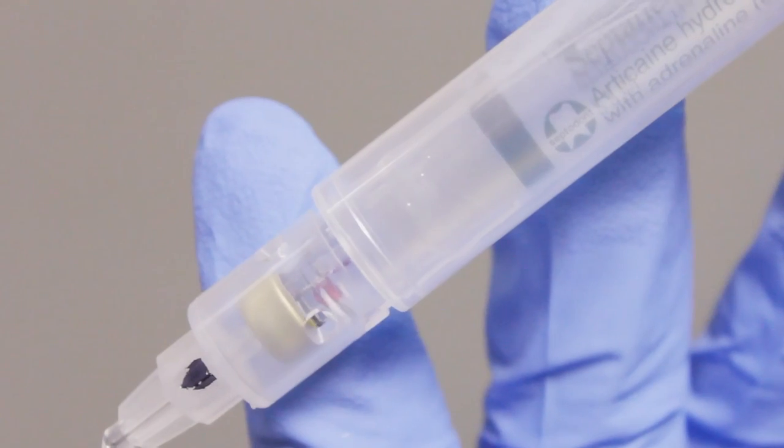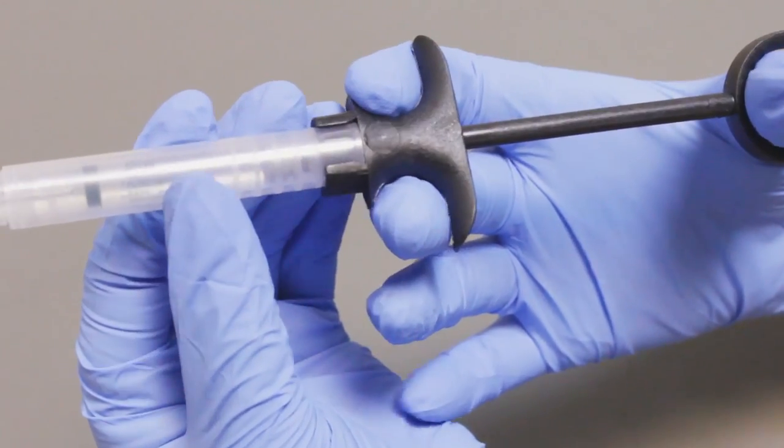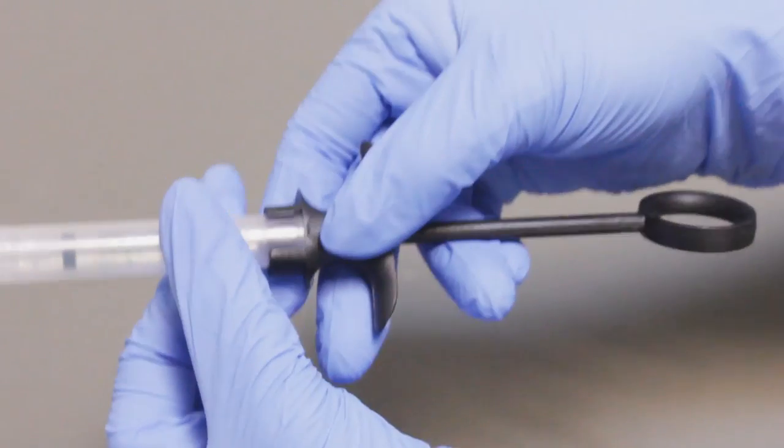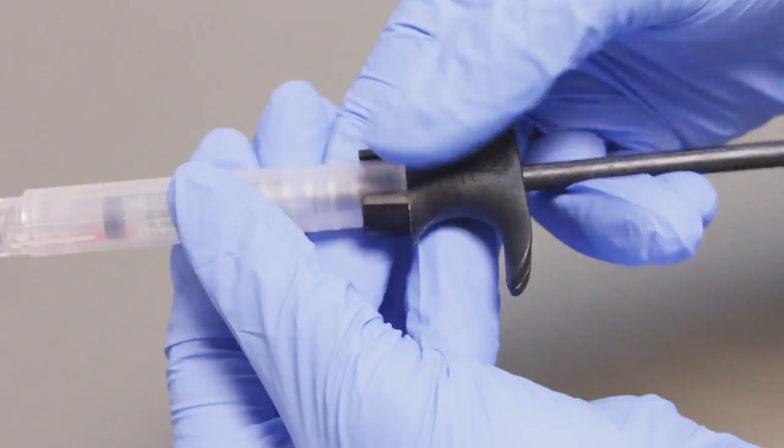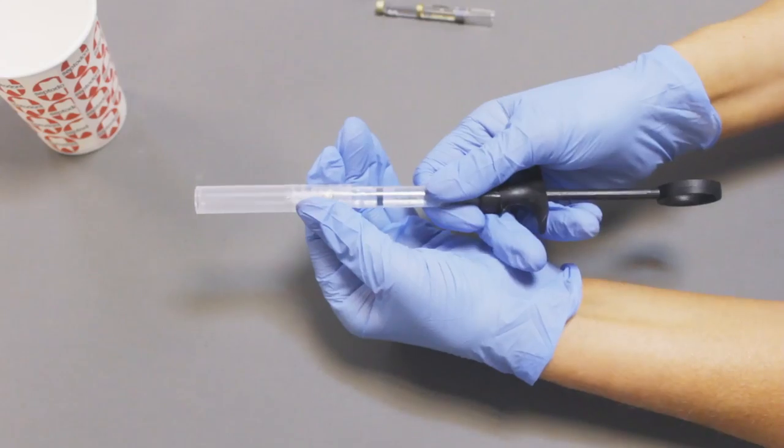Release your hand from the handle. You only hold the handle when performing the injection. Place your thumb and forefinger on the finger grips and with your other hand carefully pull the protective sheath into the holding position.